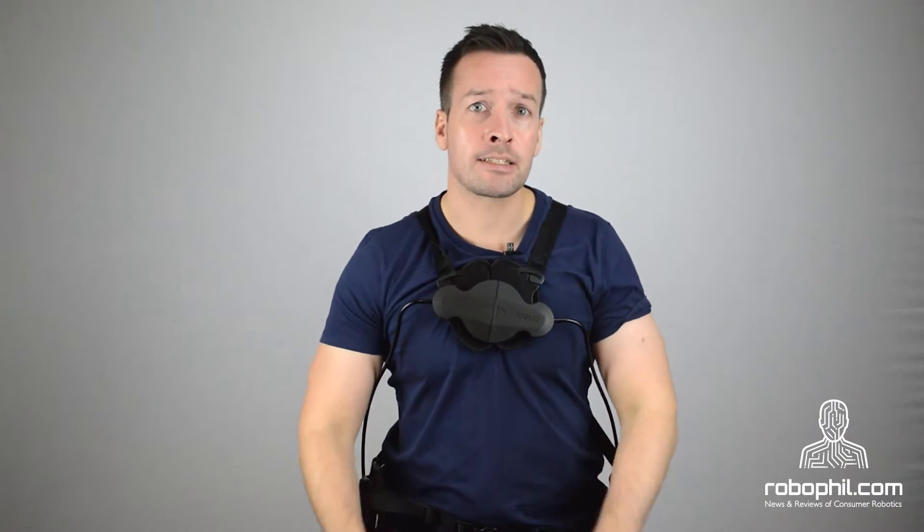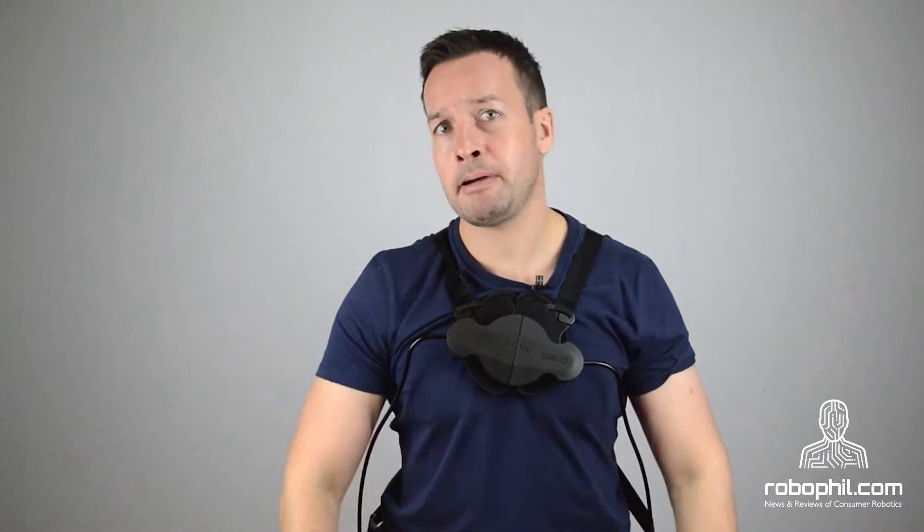Laevo began as part of the Ex-Arm project carried out by InteSpring BV and Delft University of Technology from 2010 through to 2013. Originally designed to assist nurses with lifting patients, it became apparent that the exoskeletons can be applied to multiple other working environments.